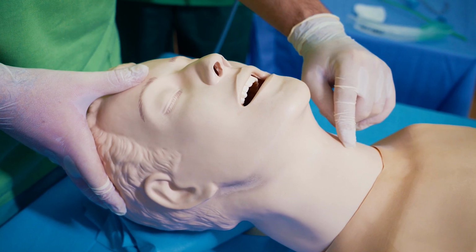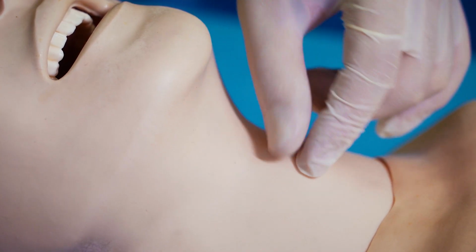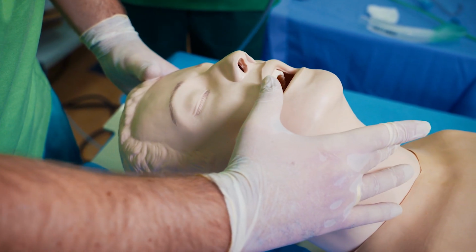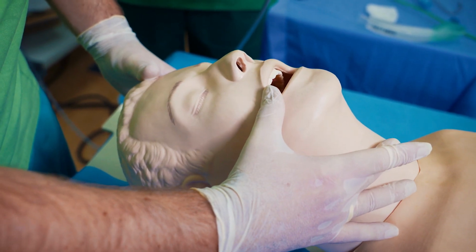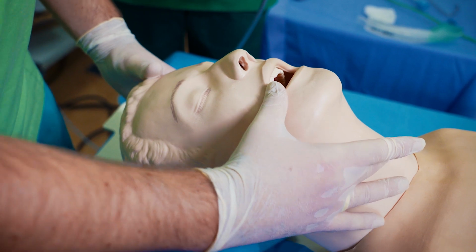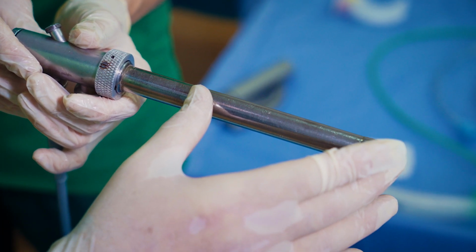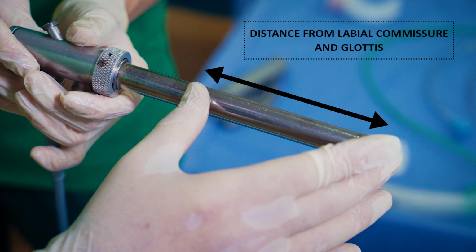Identify the thyroid cartilage by palpation of the anterior neck. Ask the patient to extend the head and measure the distance between the labial commissure and the thyroid cartilage in a straight line. Note the length obtained on the rigid tube prepared, starting from its tip. That distance is the depth at which one should expect to find the glottis when using the rigid tube.